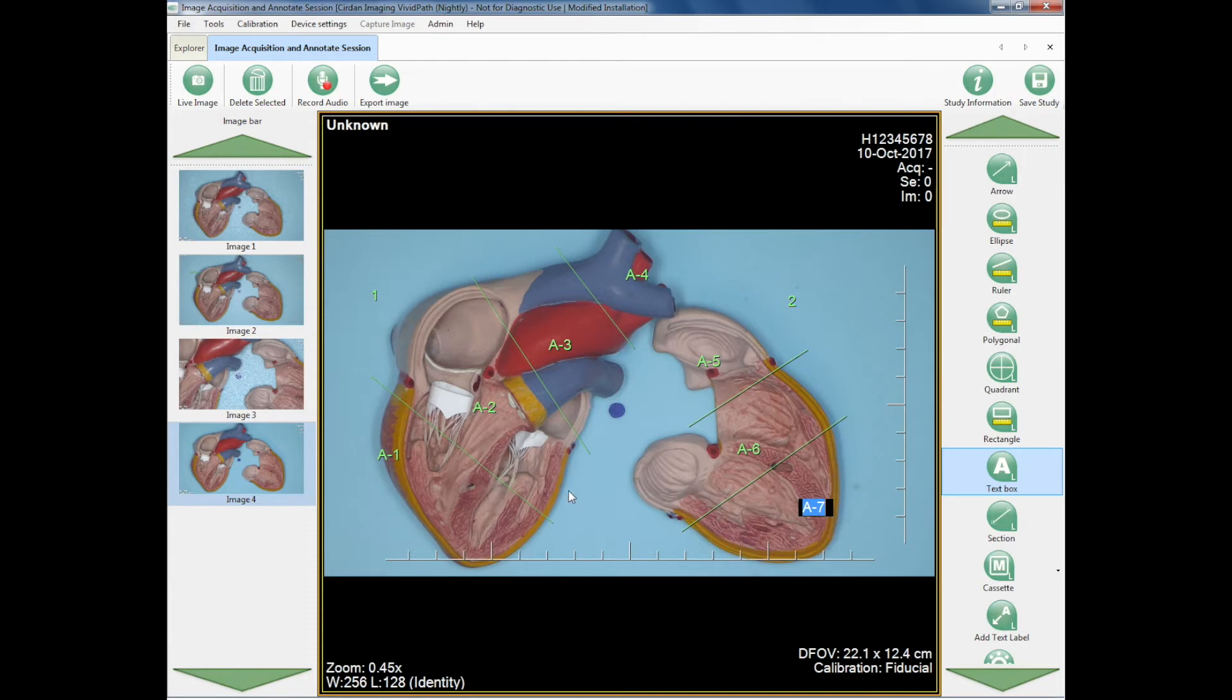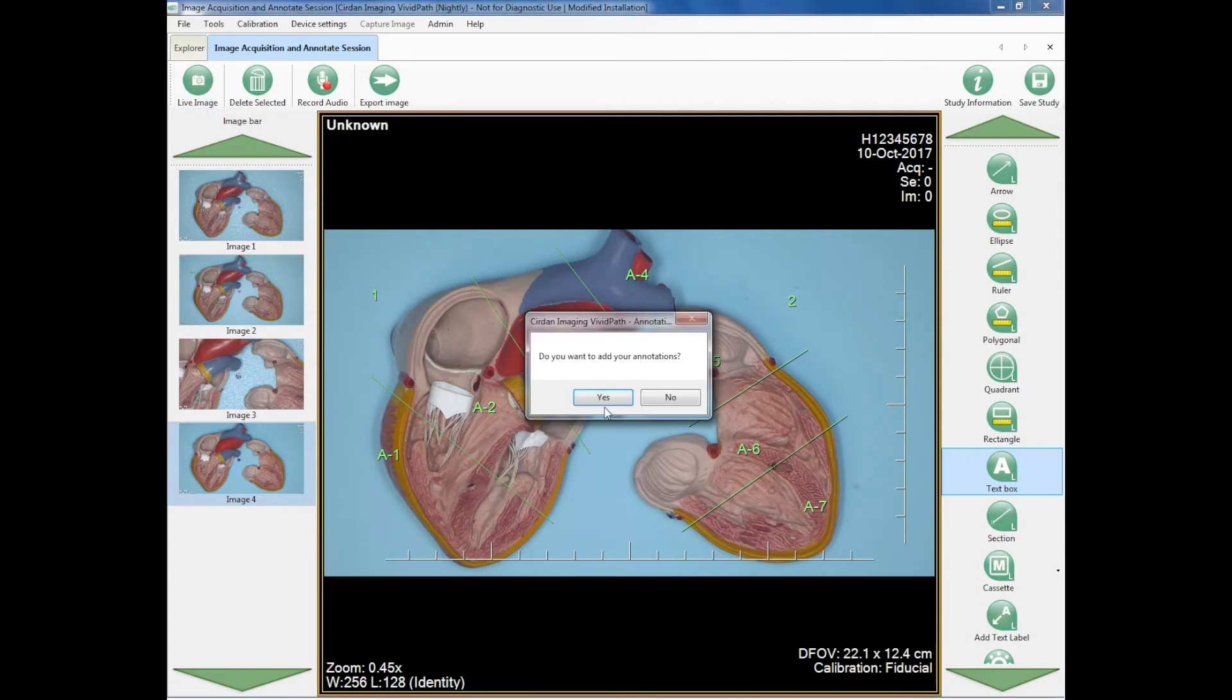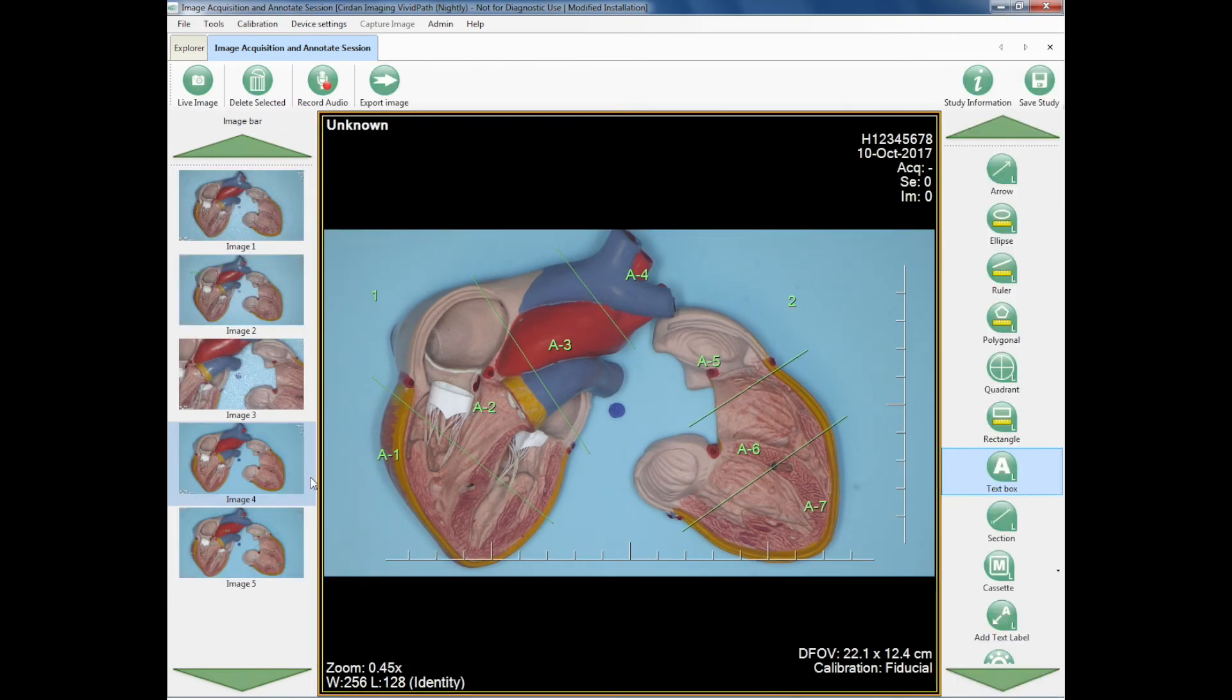So very simple, very quick, very easy. Again, I'm going to go back to the live image, save my annotations, and have a look at the images I've got so far.